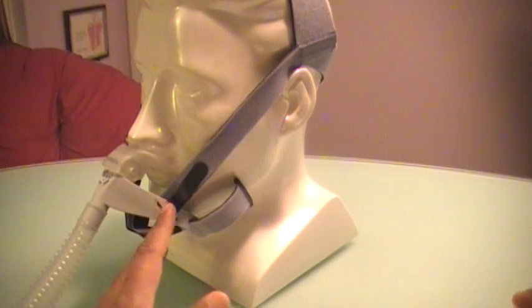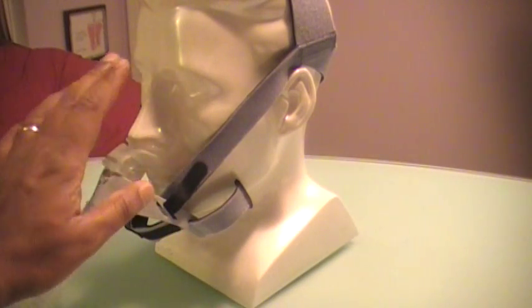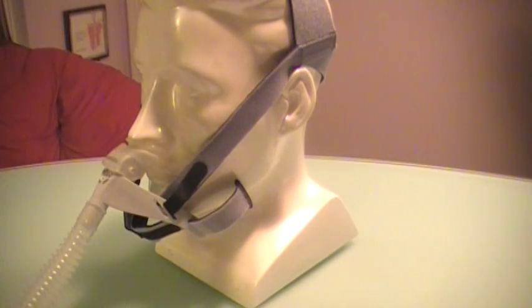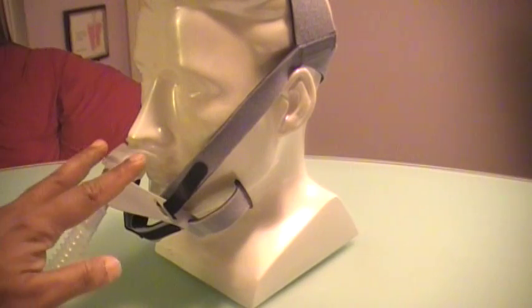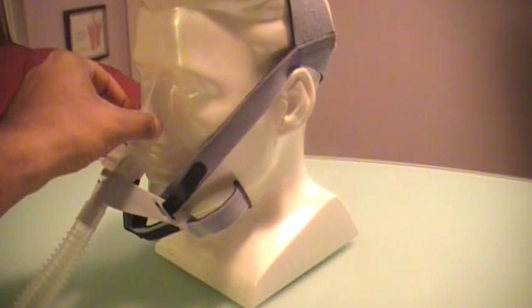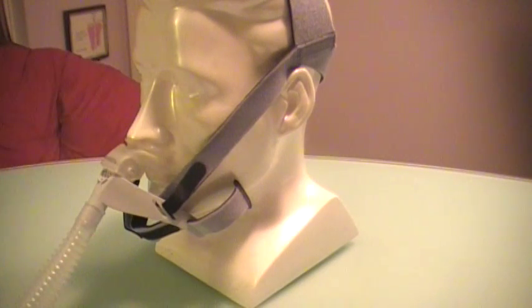Dryness in the nasal passages tends to be higher, not just because of this mask, but all nasal pillow systems, because you have the CPAP pressure and air being jettisoned right into the nostrils. All you have to do is raise your heater setting on your heated humidifier, and that will raise your humidity level, and that should take care of your dryness problem.